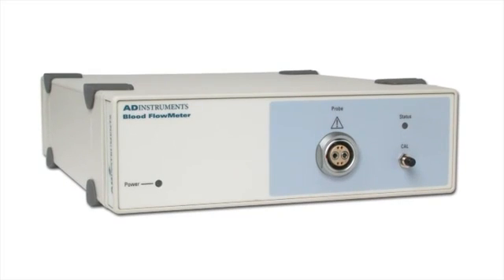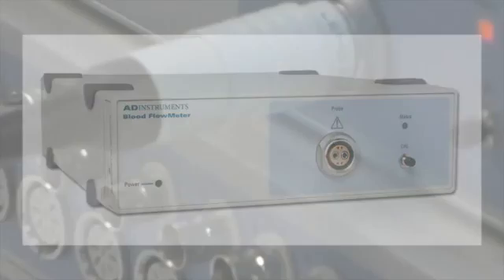The ML191 blood flow meter is a single channel laser Doppler flow meter that provides continuous real-time measurement of red blood cell perfusion in skin or other tissues.